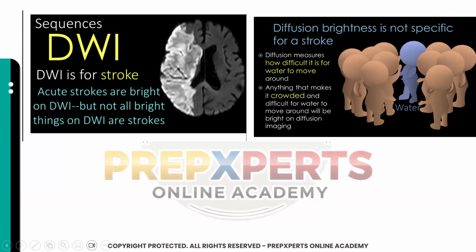Anything that makes it crowded and difficult for water to move around will be bright on diffusion imaging. So basically, DWI is showing you diffusion restriction in movement of water molecules. So anything that will disrupt water movement will make that area restricted for diffusion. I.e., we will be writing in our reports that diffusion restriction is positive or the lesion is showing diffusion restriction, etc.